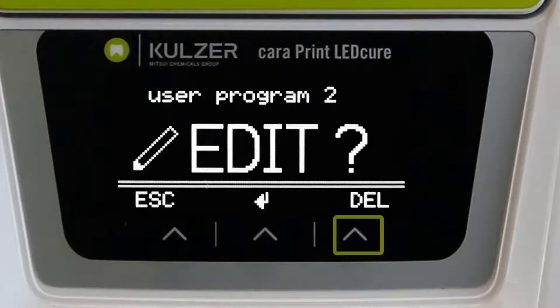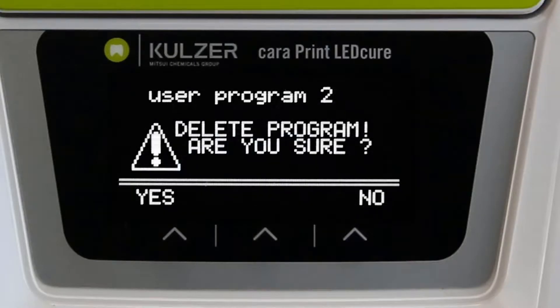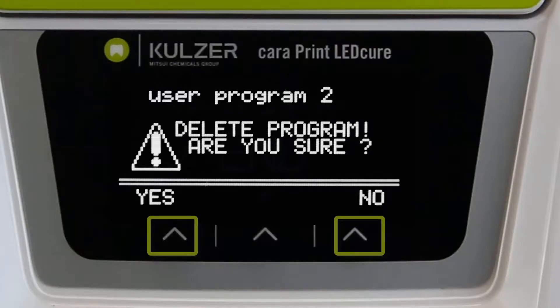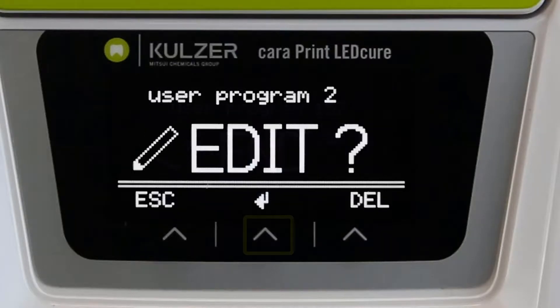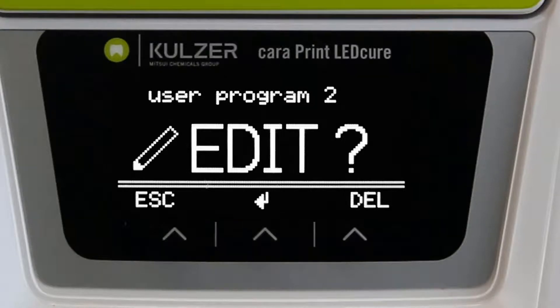With delete, the right button, the saved parameters are deleted. This process must first be confirmed with yes or cancelled with no. Use the middle button to access the individual program parameters. These can be adapted in the given order.